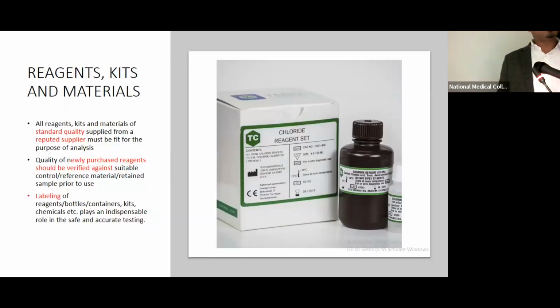And it is not just the equipment, because equipment is a one-time investment, but the reagents or the consumables that one procures should also be of good quality. They should be procured from a reputed supplier and should be of a standard quality. You should check for the quality marks on it, whether it is approved for testing or not, like whether FDA approval is there, CE approval is there. So we have to check for those things.